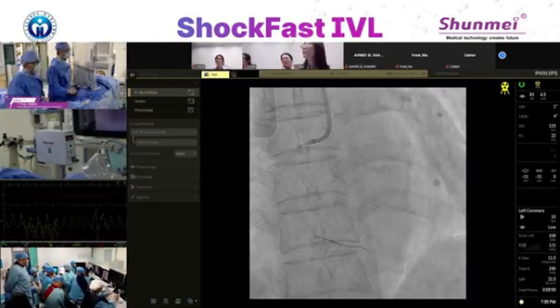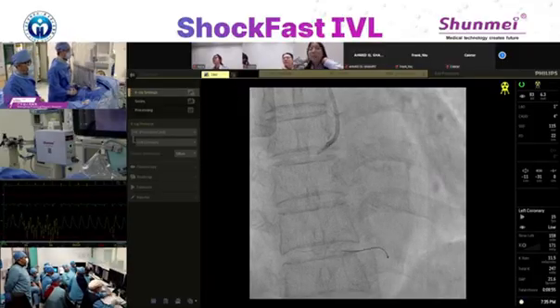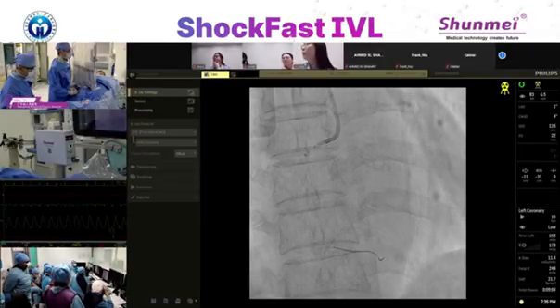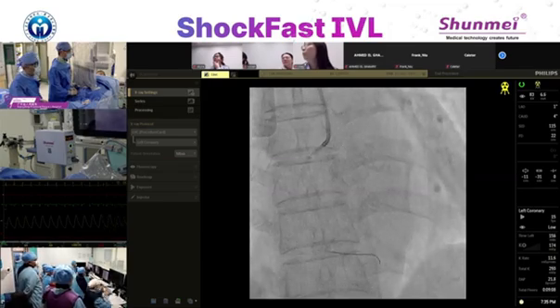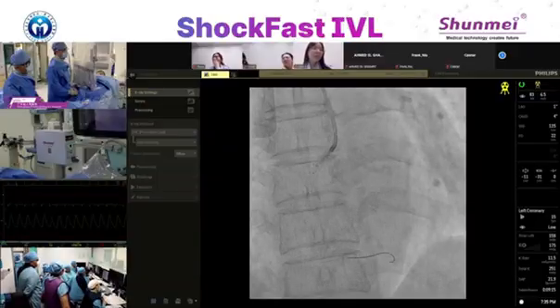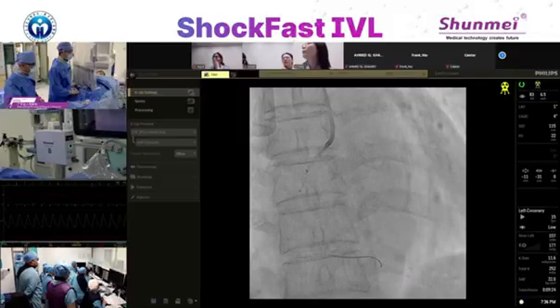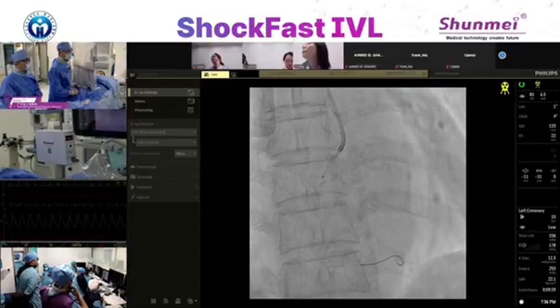Hopefully, the regular balloon can cross. God bless me. Oh my God. Ah, the regular NC balloon. We need some more X4. Can we cross? I guess we did.